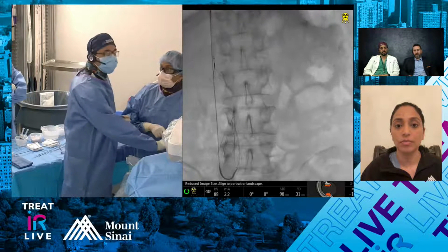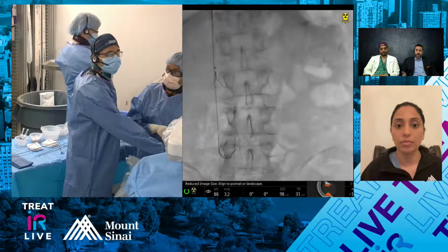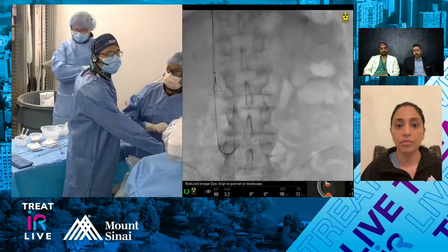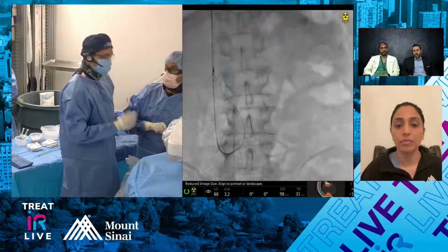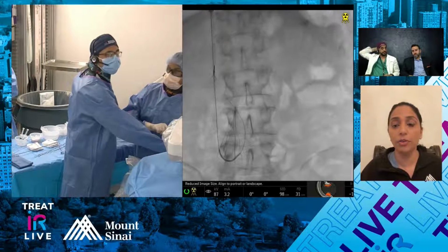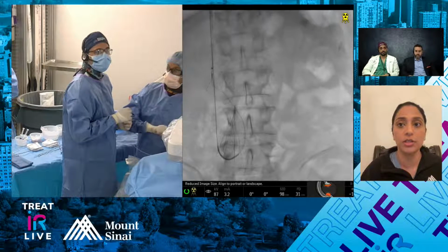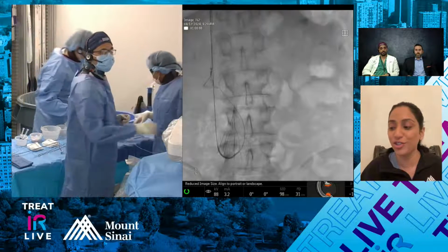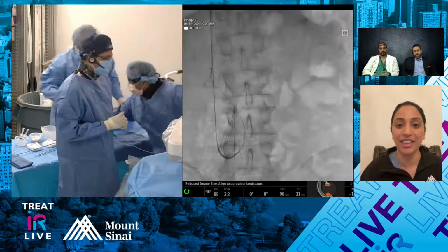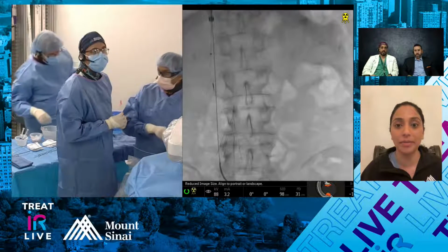Obviously we have thrombectomy technology, which will allow us to really treat things in real time, but going into it, that allows you to talk to the patient and prepare for things in a way that you otherwise wouldn't be able to. Yeah, and then you also look at clot burden, right? Like if there's any clot within the filters, are you making use of any of those distal embolic protection devices and then retrieval at the same time, or do you just anticoagulate and then bring them back?